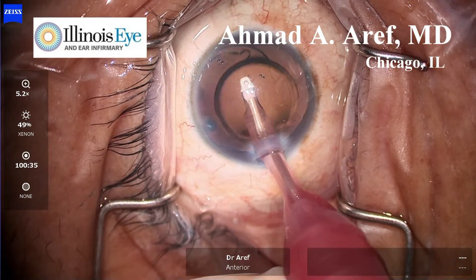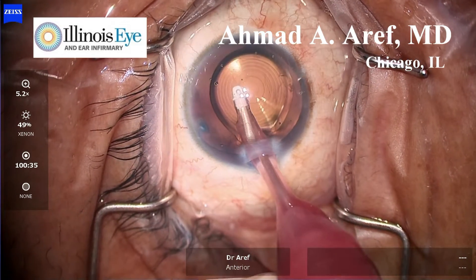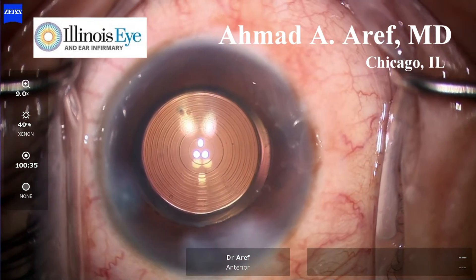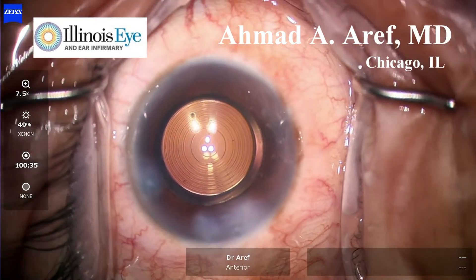Viscoelastic is removed using automated irrigation and aspiration. It's important to perform this thoroughly. Here you can see the intraocular lens nicely centered.